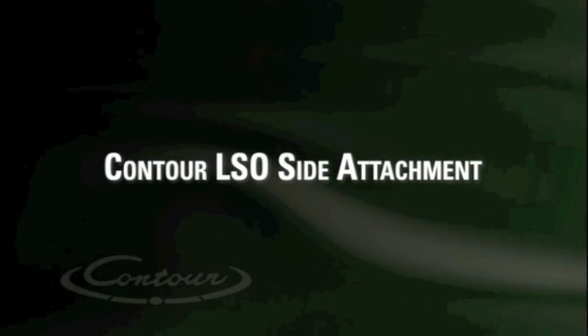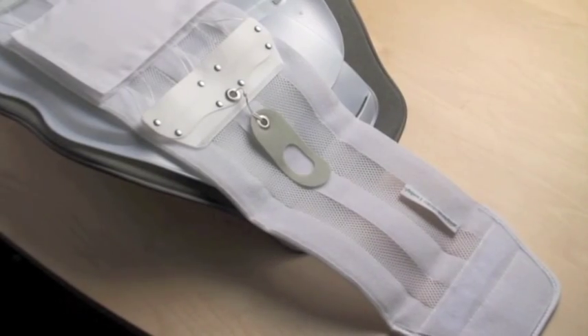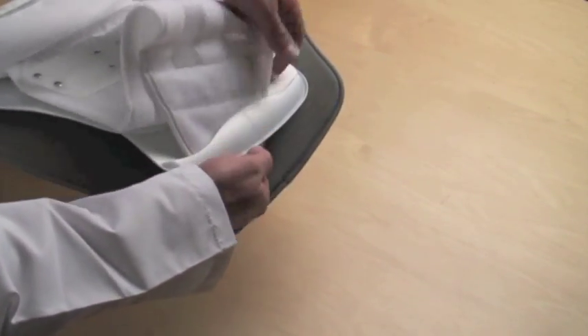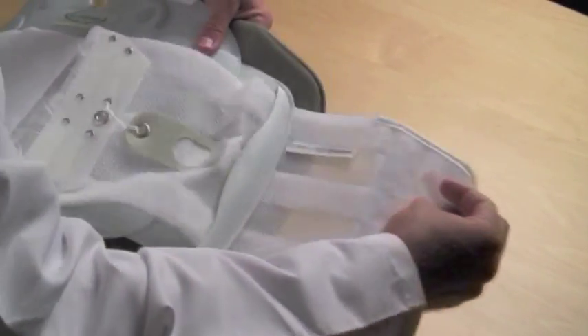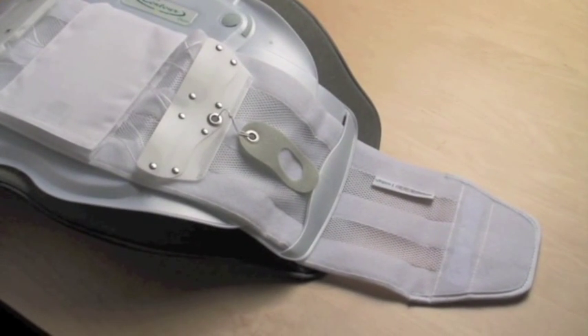The Contour LSO side attachment. When using a 15-inch back panel, there are no vertical straps. To keep the Quickdraw in place, the side panels are equipped with slots. Simply thread the Quickdraw through these slots before applying, removing the wrap if needed.